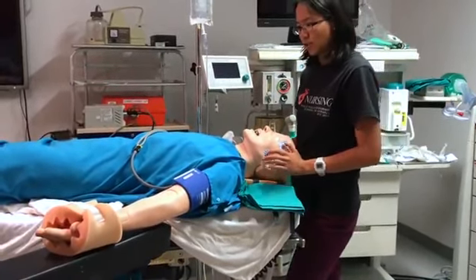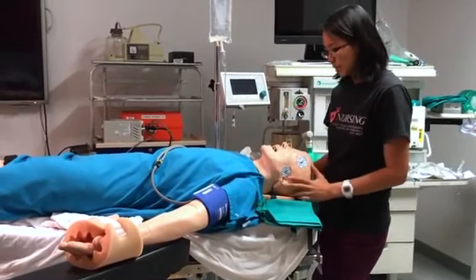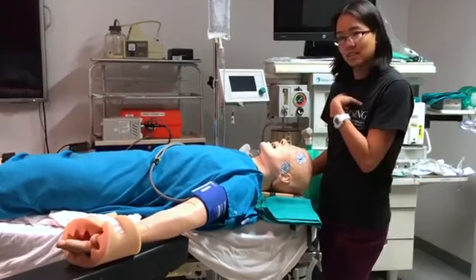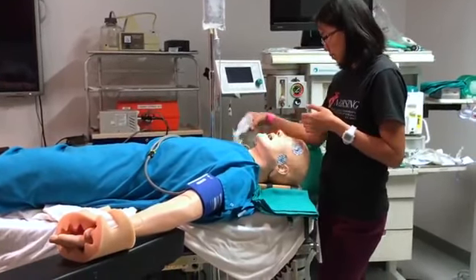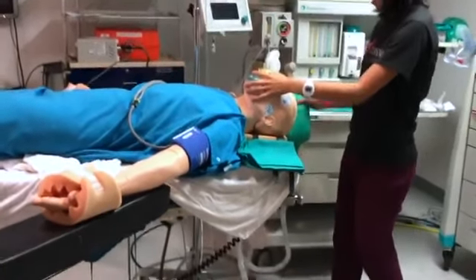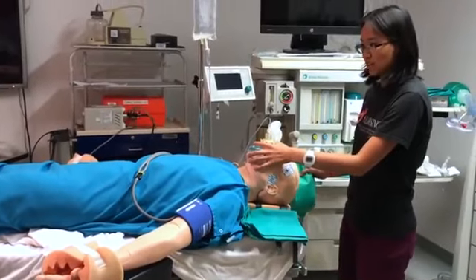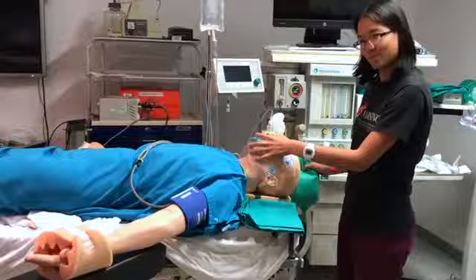The arms of the patient should be supported, or at least on arm boards like this, so that's perfect. And then for me as an anesthetist, I want to be at the head of the bed facing the patient. You also want your left hand to be on the mask and your right hand on the bag. This is the standard position that you'll be in for the case. So that's it.